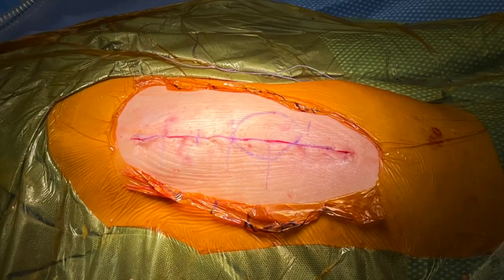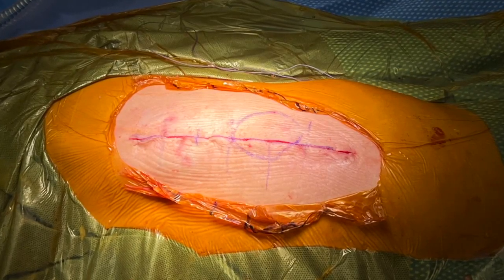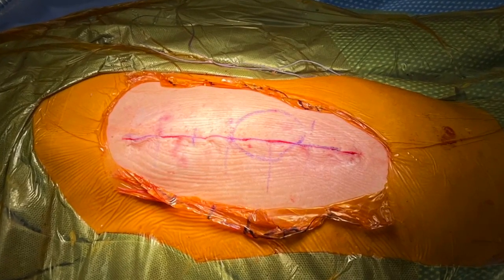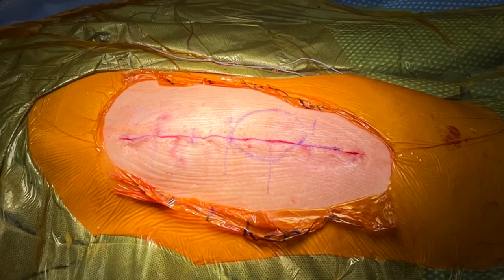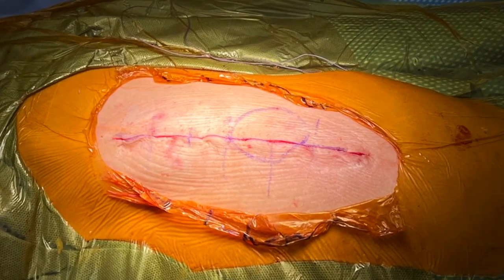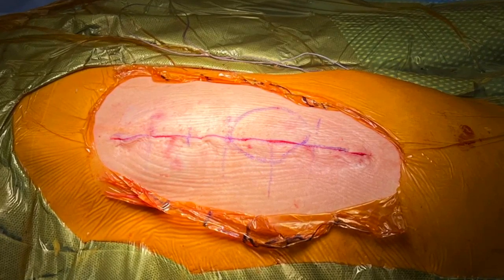Here on the left hip, we've closed the skin with a running 3-0 monocryl subcuticular after closing the dead space and injecting a long-acting anesthetic. This keeps tension off the skin edges and we cover it with an aqua cell dressing which we take off at about 10 to 12 days.